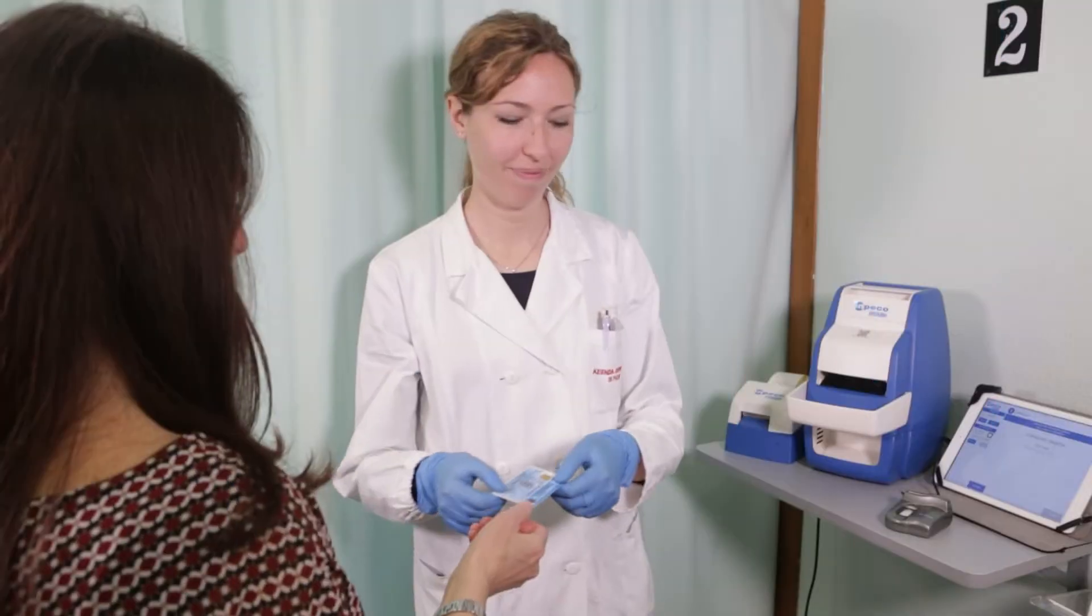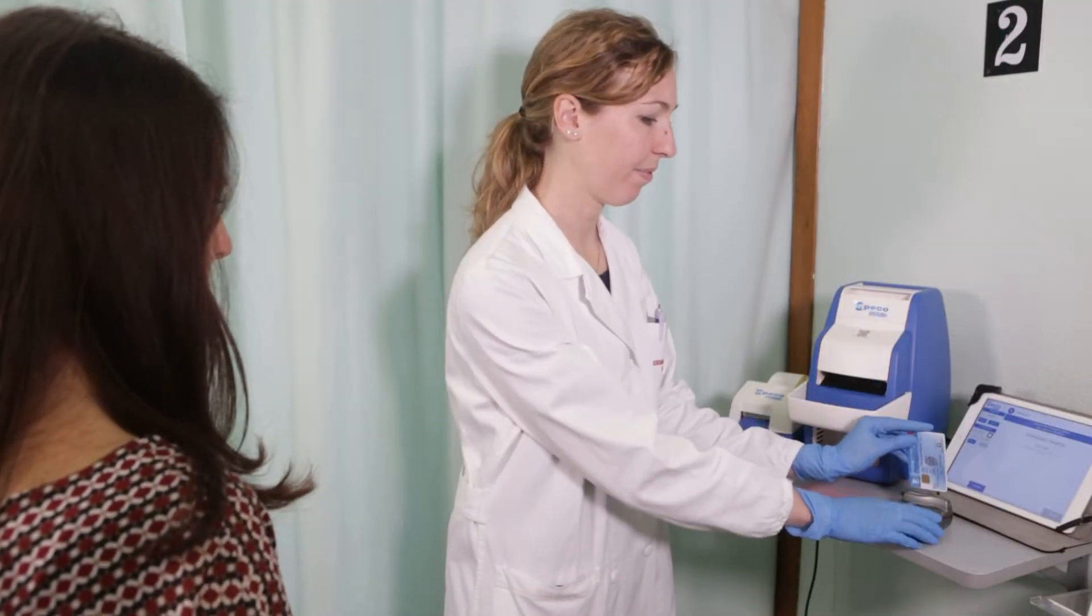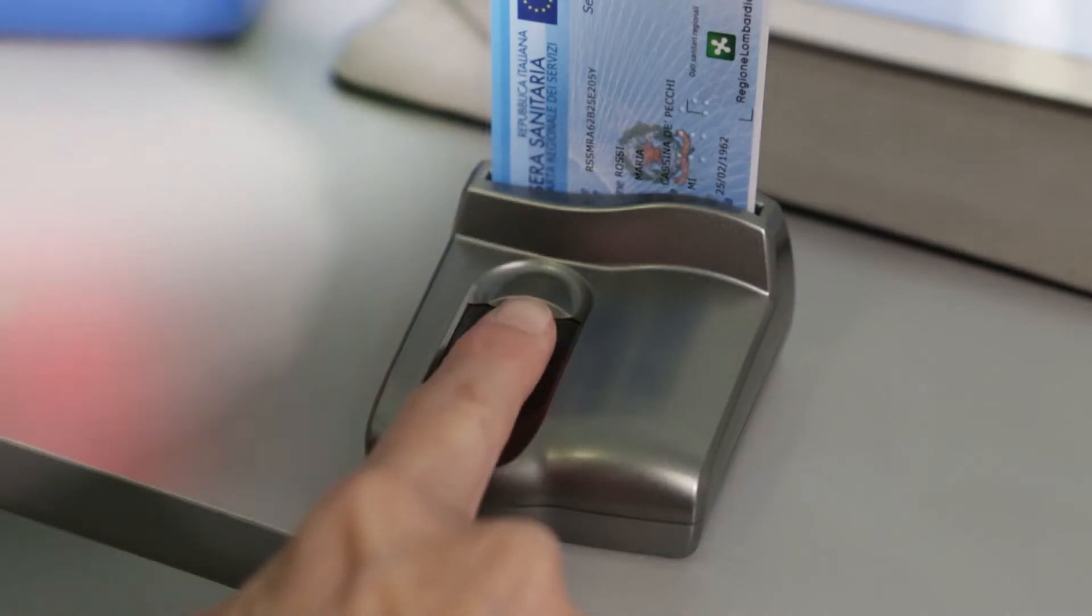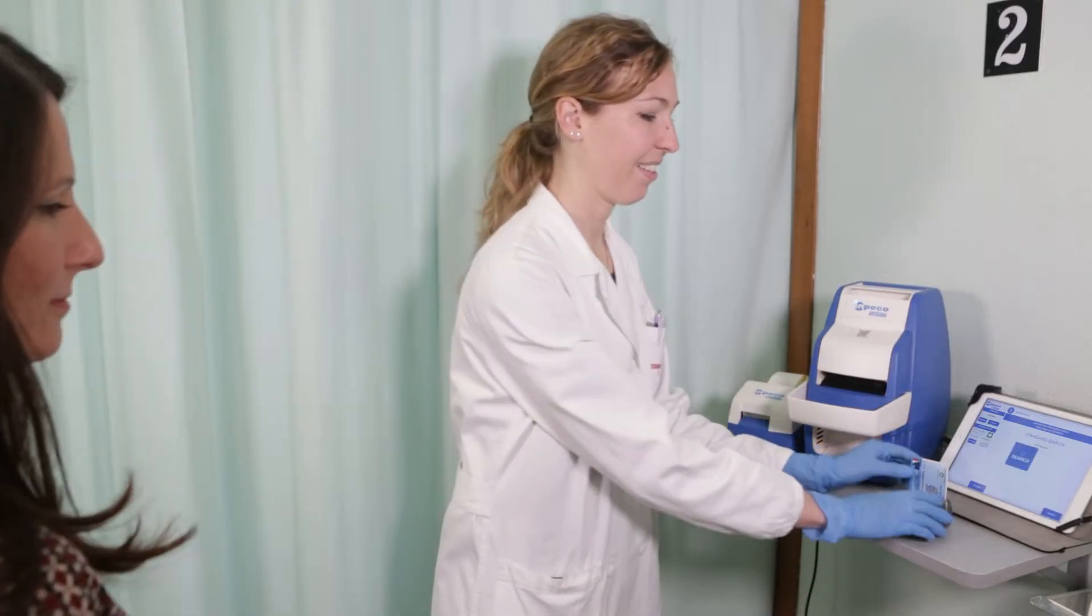Our ProTube solution is designed to avoid errors. Positive patient identification is achieved through biometry, wristband, national ID card, and requisition form.